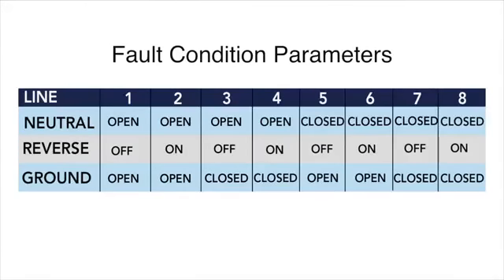There are a total of 8 different conditions that may be configured. Please refer to your appropriate safety standard to determine which conditions apply to testing on your product. When in doubt, it is recommended that all 8 line conditions be run in a single test sequence. This ensures that all possible test cases are covered.